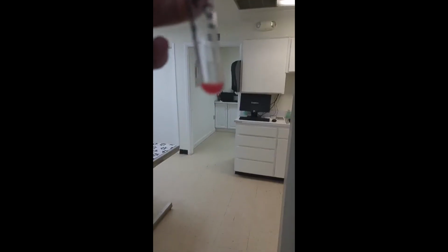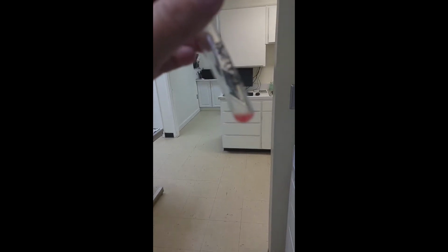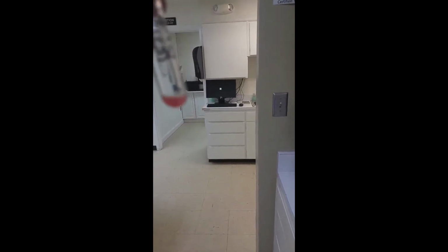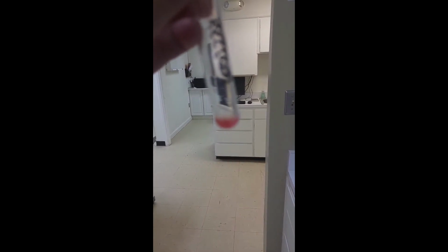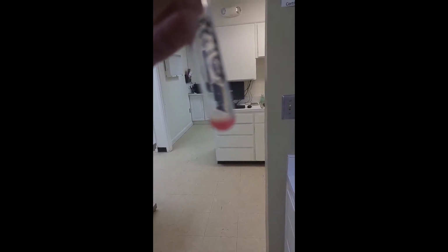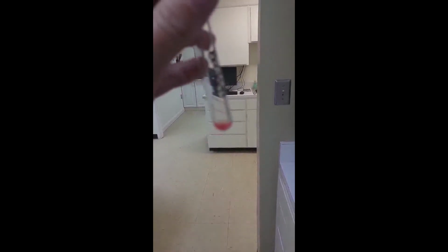Because of the agglutination that is in here, it is pretty significant. They would not be compatible as far as donor and recipient, and we would need to select a different donor to see if it would be compatible.